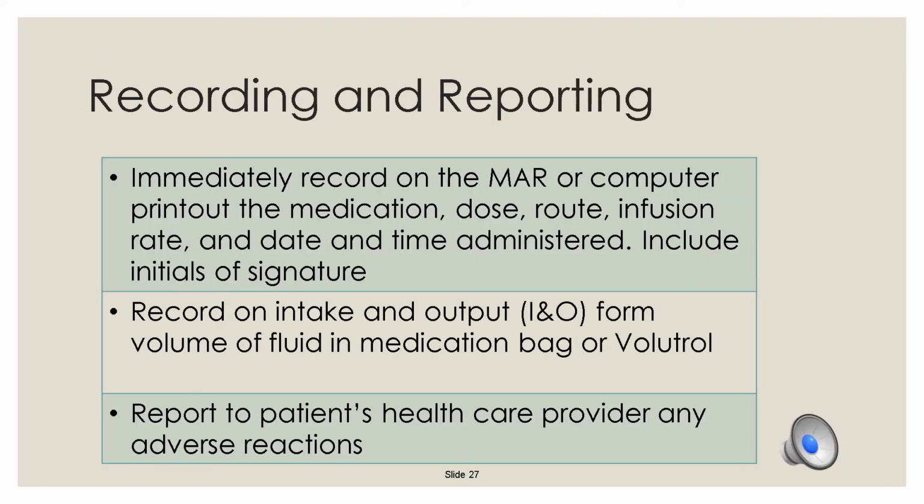When giving IV piggybacks, you need to remember that you need to give medications on time. These are typically critical meds that are given as IV piggybacks, so you need to give them 30 minutes before or 30 minutes after the scheduled time. If it's a non-critical medication, you can give it within 1 to 2 hours of the scheduled dose. And the patients may have multiple meds scheduled at the same time.